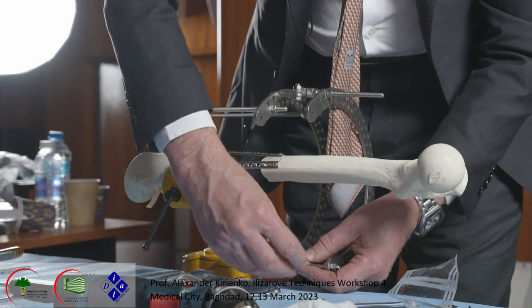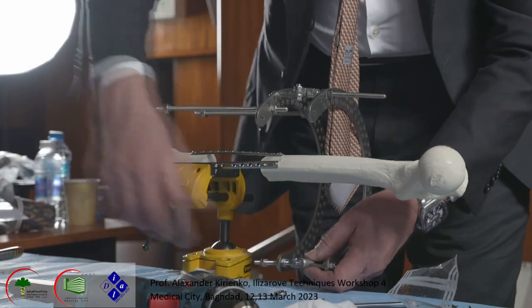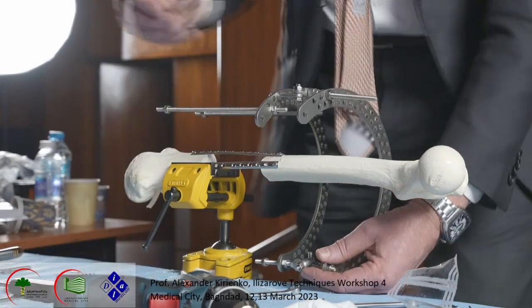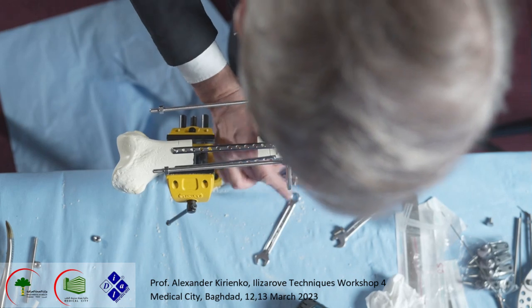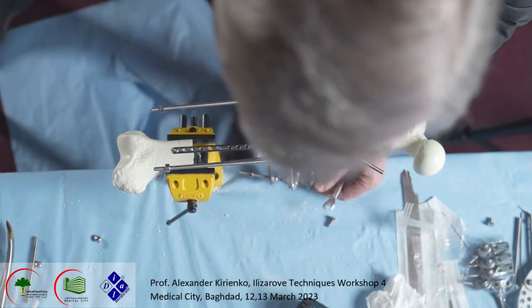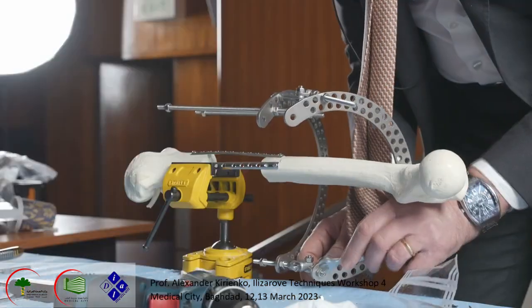And this way we displace the proximal ring more lateral. And we create biplanar hinges for correction of deformity that may arise during lengthening. Okay, like this. Always overlapping these hinges because they should move simultaneously in the same plane.